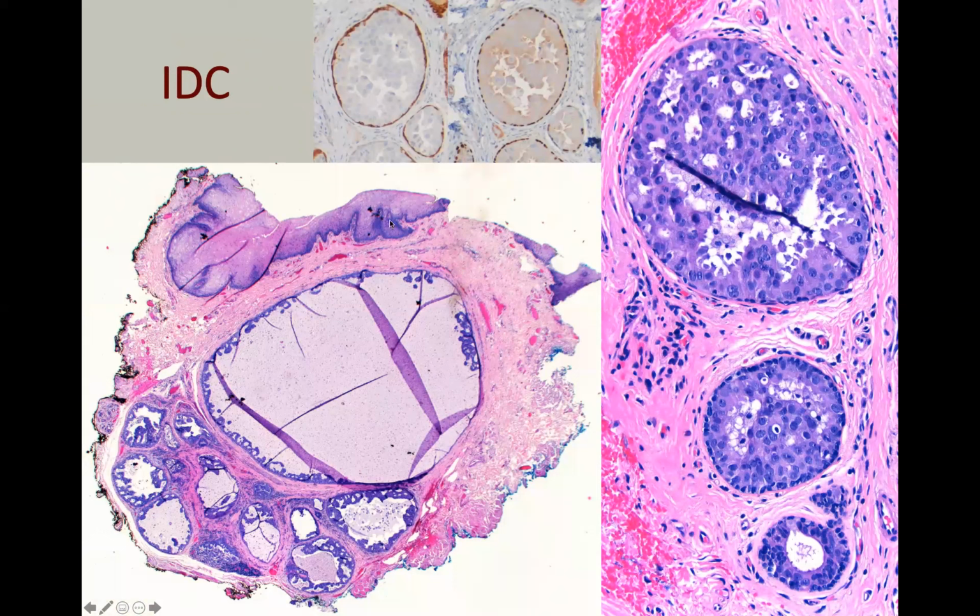So we're in a mucosal site. We can see squamous mucosa up here. So we're in a minor salivary gland right here. Multiple cysts with proliferation into the lumen, but P63 or P40 or SMA nicely highlighting the myoepithelial cells.